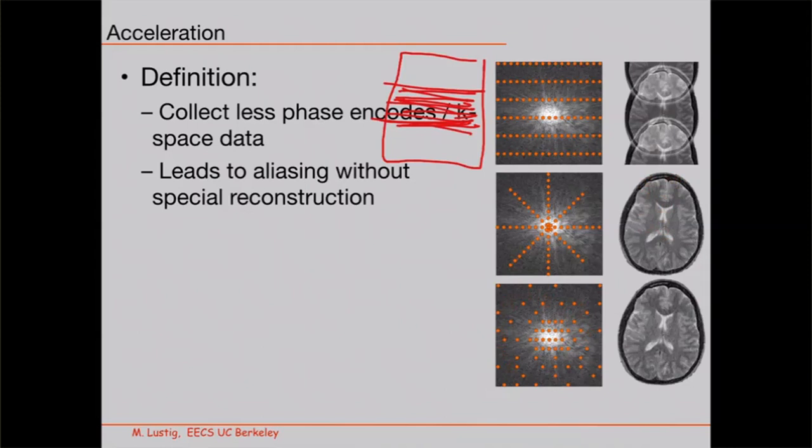What kind of trajectory is that at the bottom? Like, if it's just random, do you still use like a Cartesian or something? Yeah, you can. This cannot be done for 2D, but for 3D, where the readout direction is actually through that k-space, then for every phase-encode you could just collect a different one. So yeah, you could.